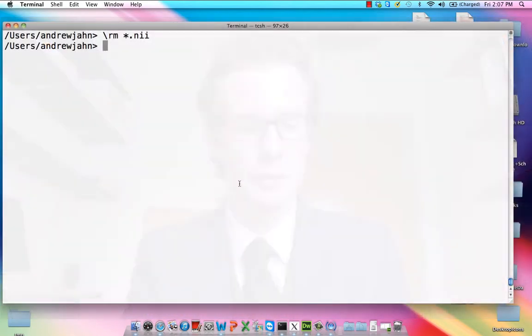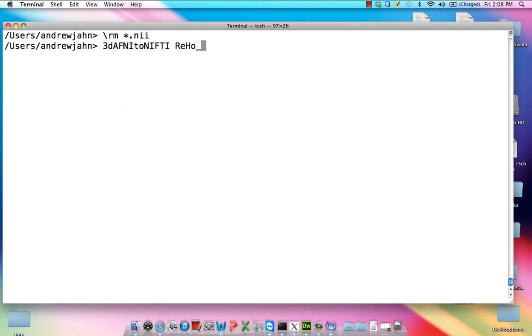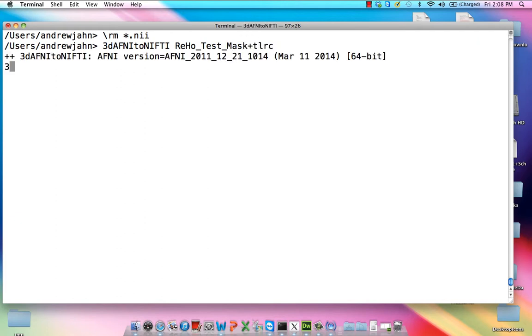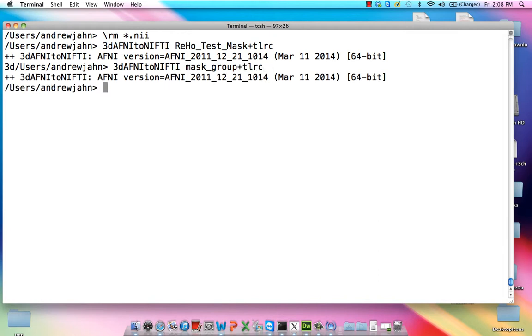So first things first, what we need to do is convert our AFNI data to NIFTI format. And we're going to do that for the regional homogeneity dataset that we created. And we're also going to do that with our group mask for reasons which I will discuss presently.